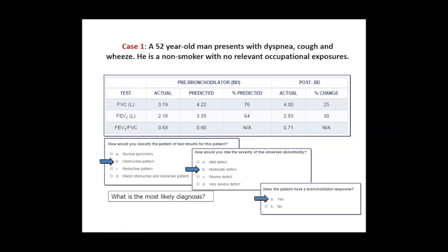So what's the most likely diagnosis, do you think? This patient, according to his history, of course, and other clinical symptoms with his lung function testing, might have asthma.